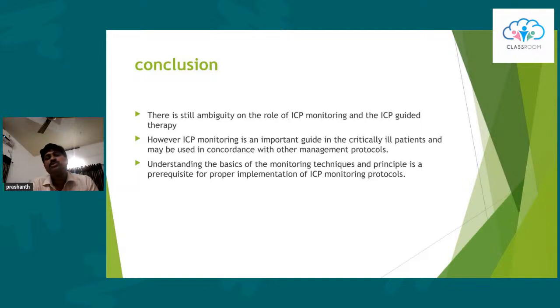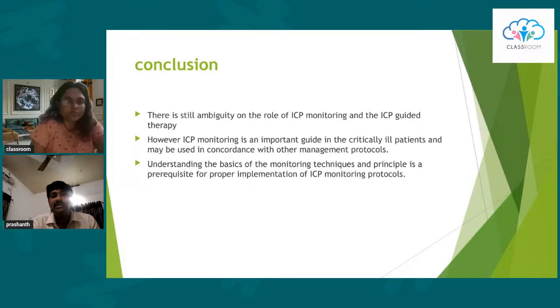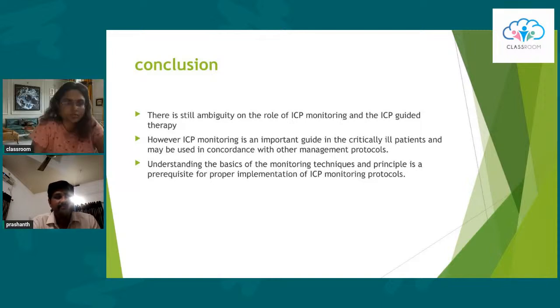So in conclusion, there is still ambiguity on the role of ICP monitoring and ICP guided therapy because we don't have very strong evidence to support them. However, ICP monitoring is an important guide in critically ill patients and may be used in concordance with other management protocols. So understanding the basics of the monitoring techniques and the principles is a prerequisite for proper implementation of ICP monitoring protocols. Thank you.